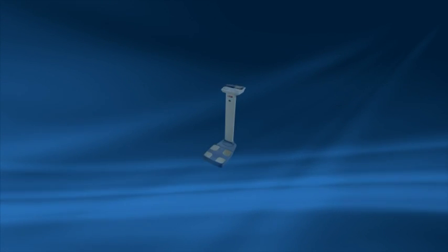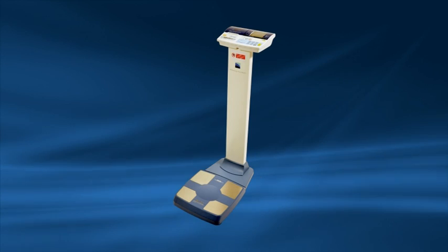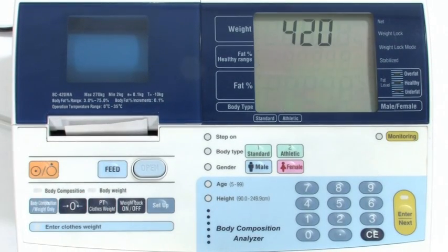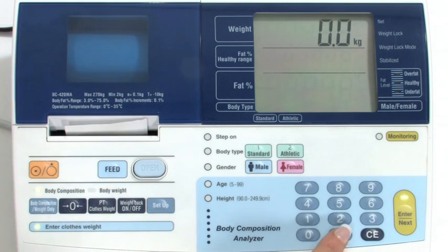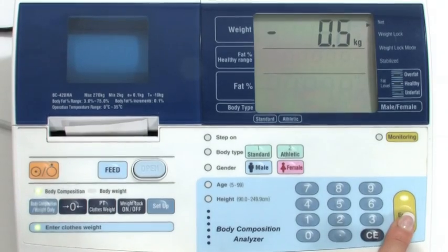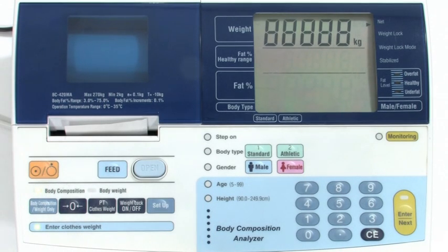Once your analyzer is set up, you are ready to take a reading. First, press the on button and wait for zero to flash. Then input a clothes weight — the weight input will be deducted from the user's weight. One kilogram is typical. Press enter. The pre-tare clothes weight will then be set for all readings until the analyzer is switched off.